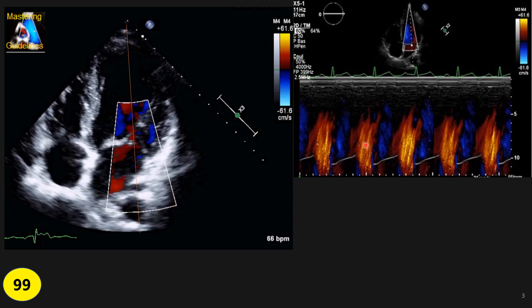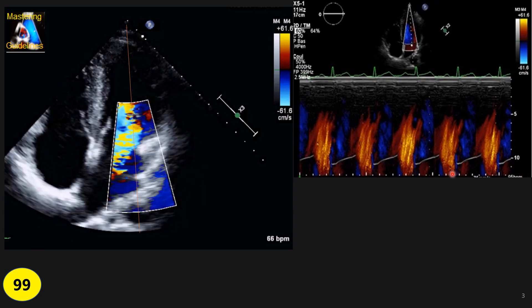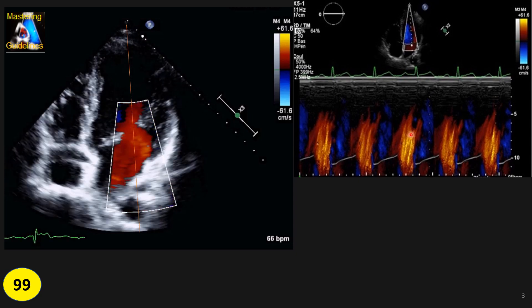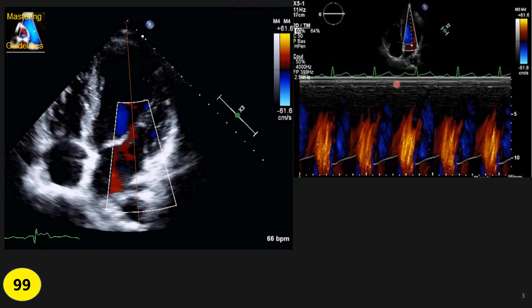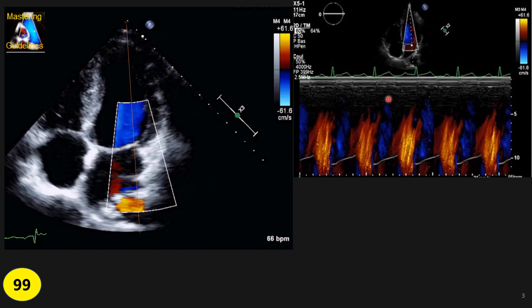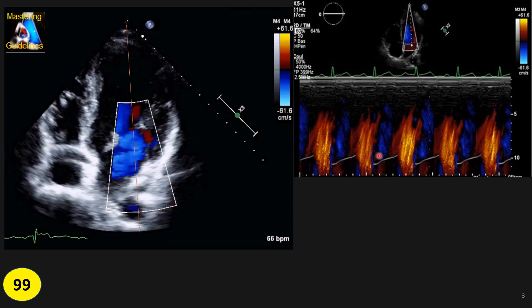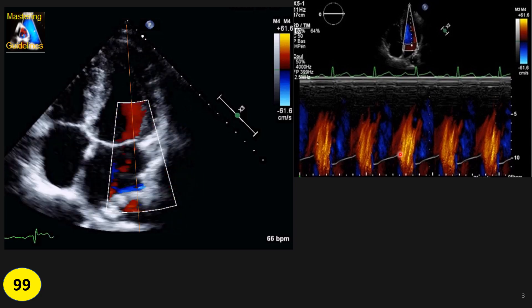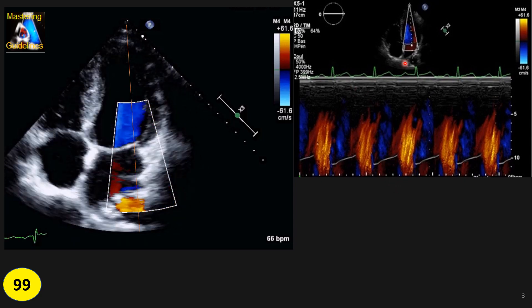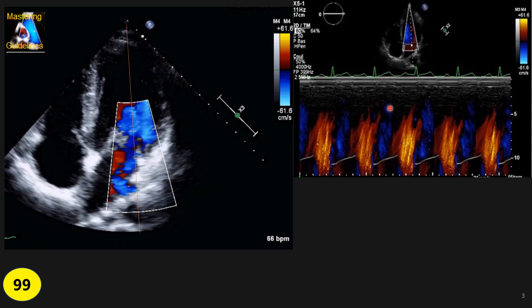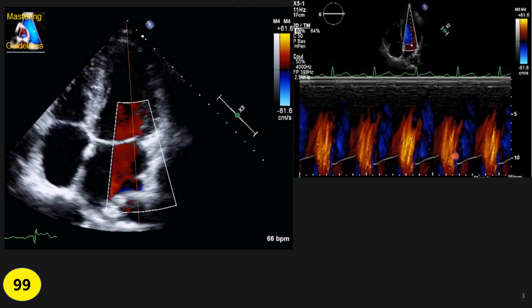With systolic and diastolic phases visible, those two colors represent the blood flow in this color M-mode Doppler. You can appreciate two types of flow here: one corresponding exactly to the E wave and another corresponding to the A wave. Here is the mitral valve and here is the apex of the heart. For performing VP, we increase sweep speed to around 50 — 50 is the best.